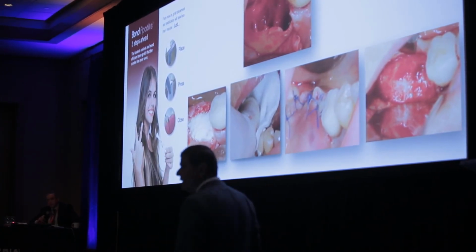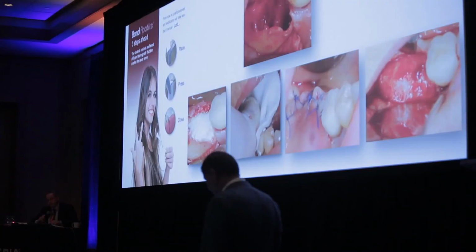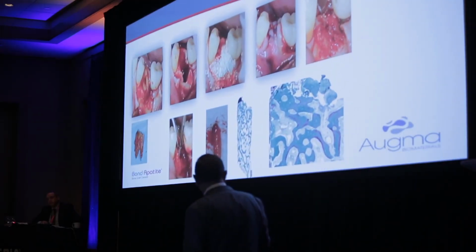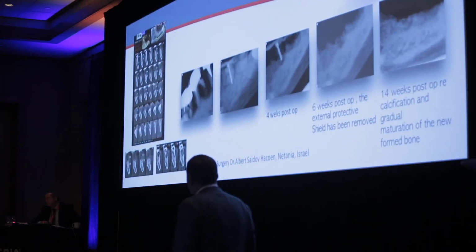This is the bone that we're going to have. Patient on bone. Is it bone? Definitely we need to take some histology. You can see the quality of bone that we gain here. Now, radiographic appearance. Again, at the day of placement, it's radio opaque.